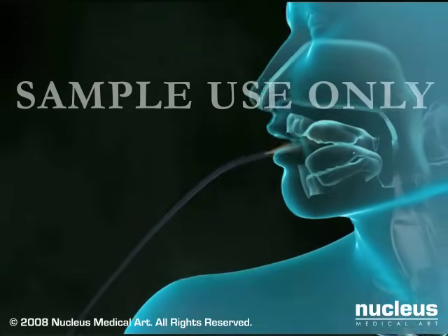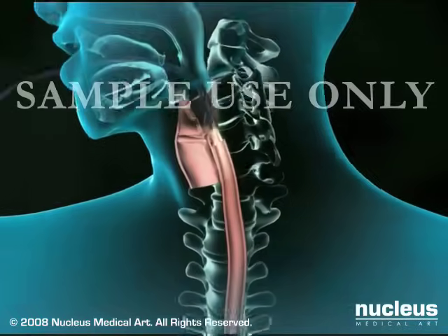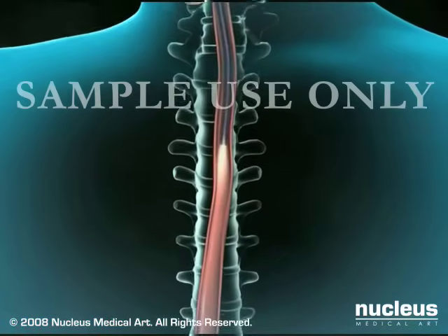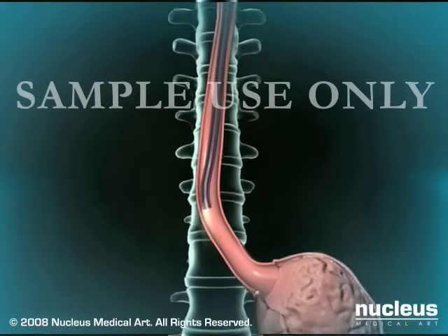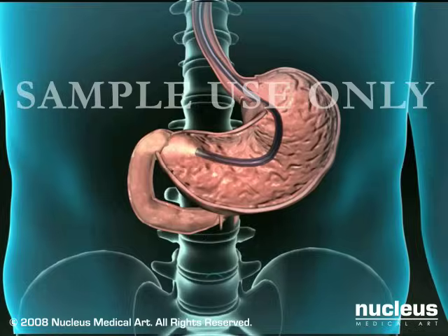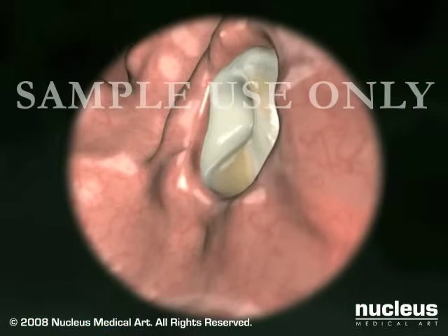Uncomplicated upper endoscopies take between 10 and 20 minutes. Your doctor will gently insert the endoscope through your mouth and then slowly and carefully move it down your esophagus until it reaches your stomach, and finally your duodenum. You should feel no pain as this is happening.